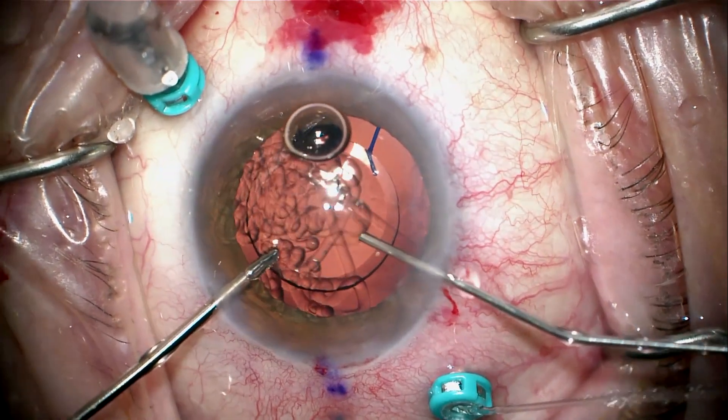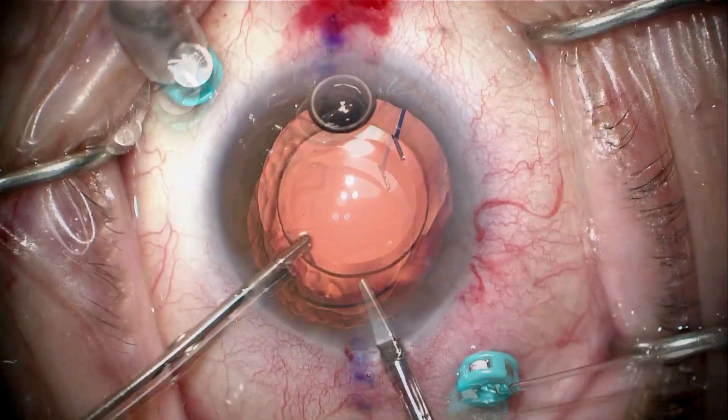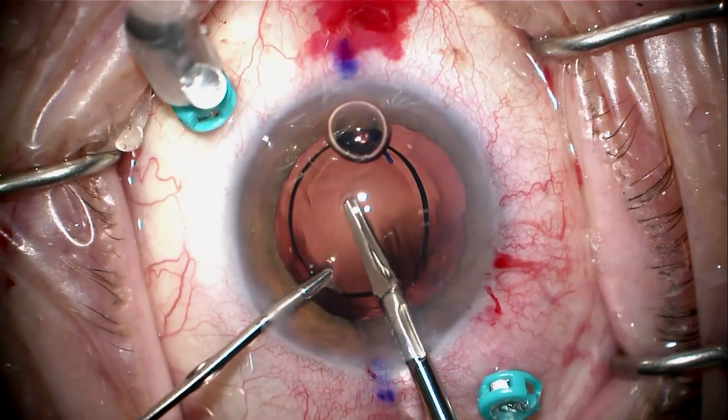I'm going to place a dispersive viscoelastic in to protect the cornea. I need a backstop to use that viscoelastic, otherwise it will just fall back into the eye. With the lens held in place I can inject that and start cutting the lens.